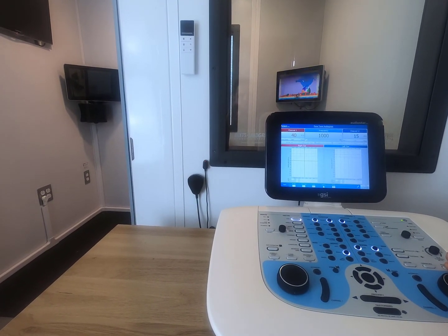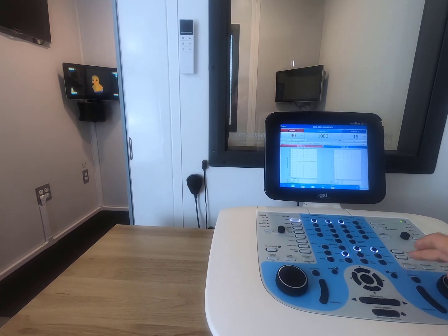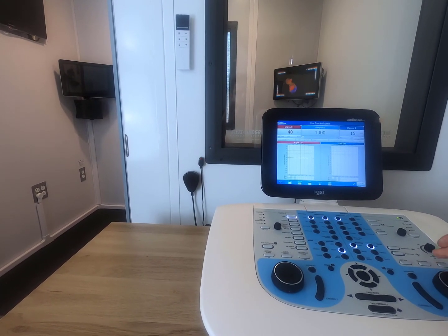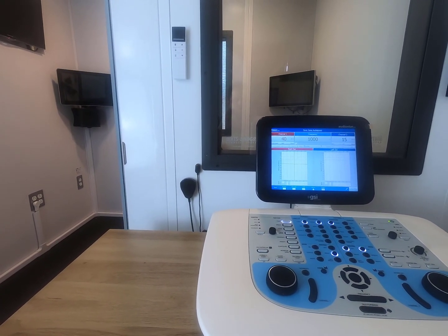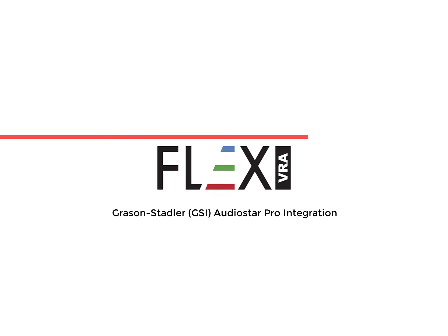With everything installed, we want to test to make sure that our positioning is good for the IR sensors. The way we can really know if we have a good position is how responsive it is to rapid movement, so we'll do those here real quick. And that would be a good installation of the Flex VRA integration cable to the GSI AudioStar Pro.